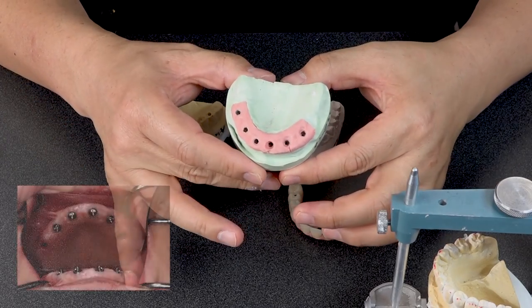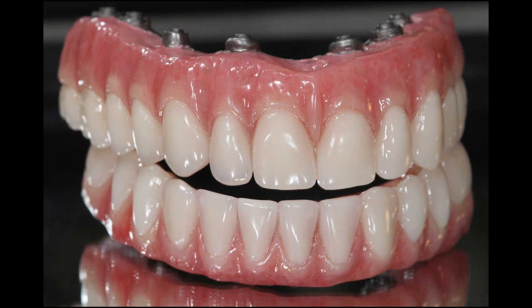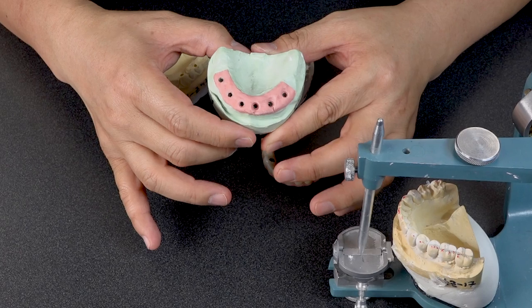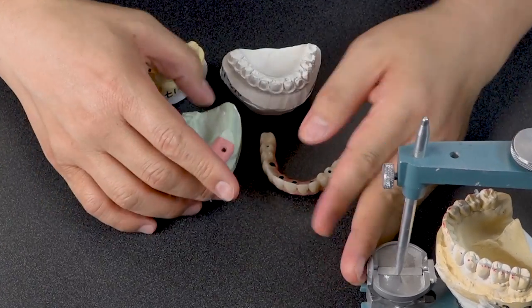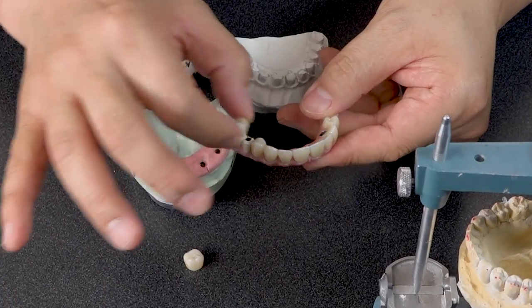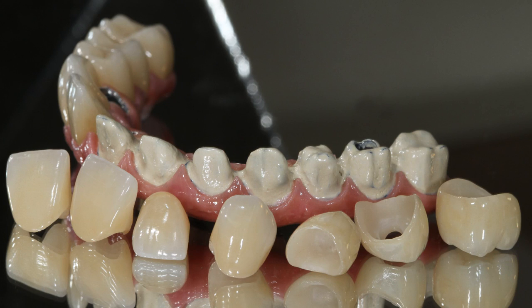Number one, you can do this kind of implant. You can make the screw-retained denture with the full-mouth. You can do screw-retained zirconia. This case we fabricated — called 7-star cases — which means individual looking. All individual, one set. So that patient can floss.